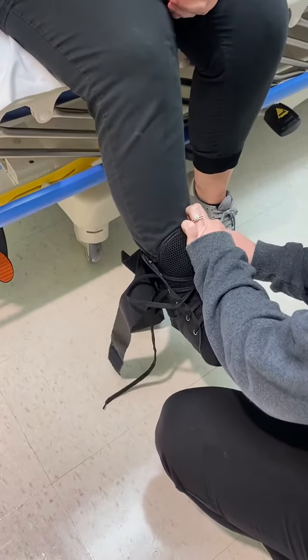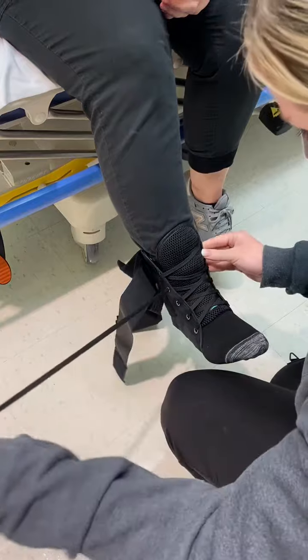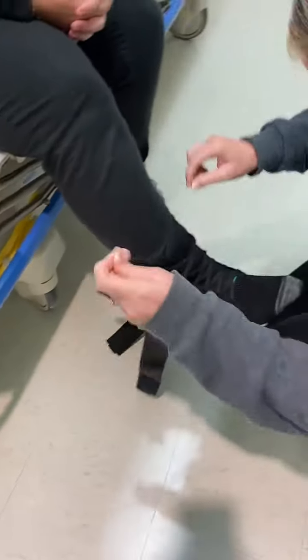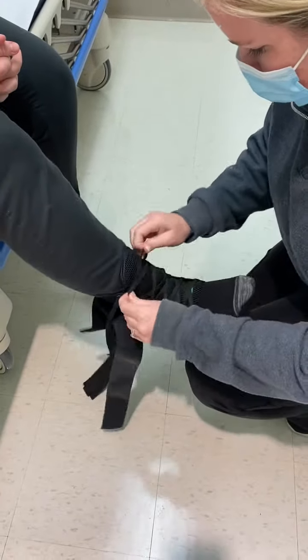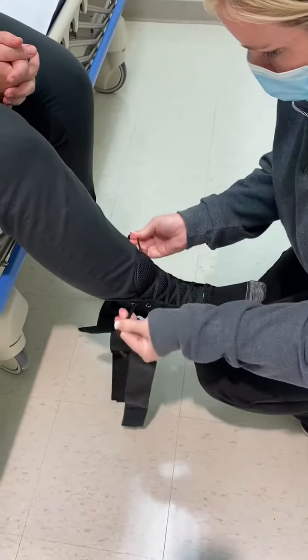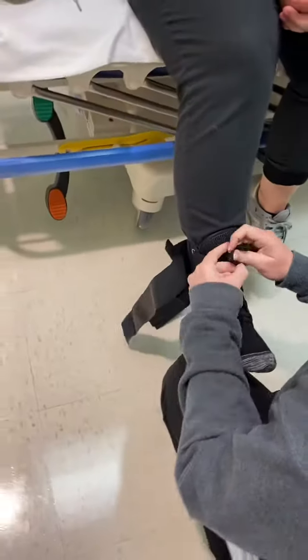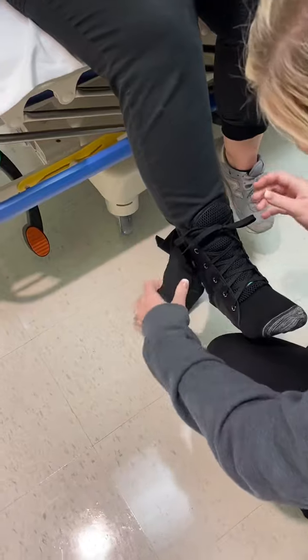Once you get it laced to the top, make sure you tighten it again just like you would your sneaker, and then tie it just like you would your sneaker.